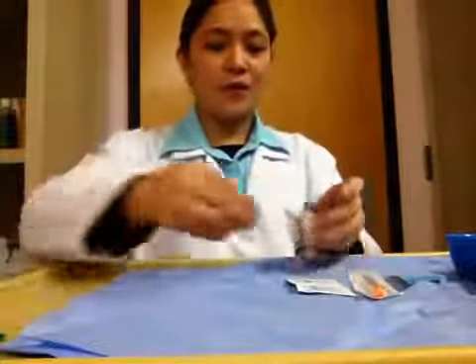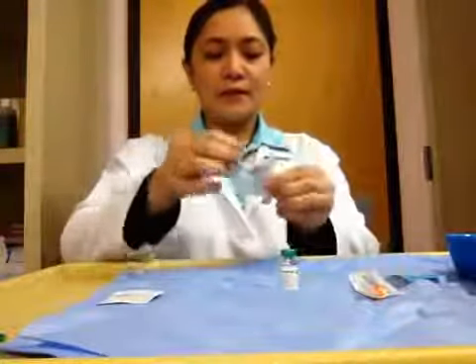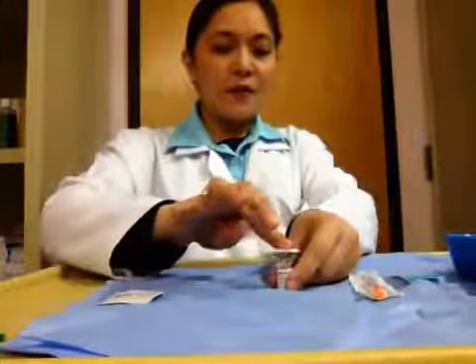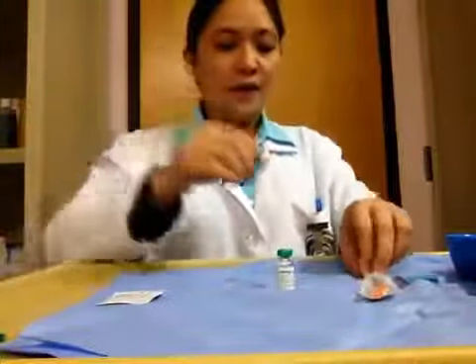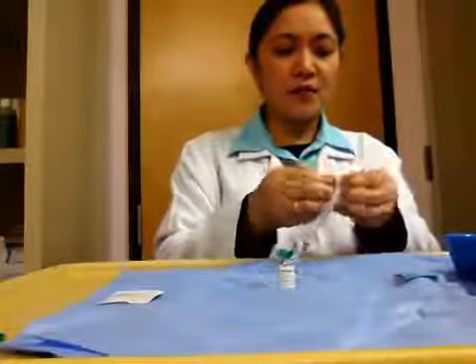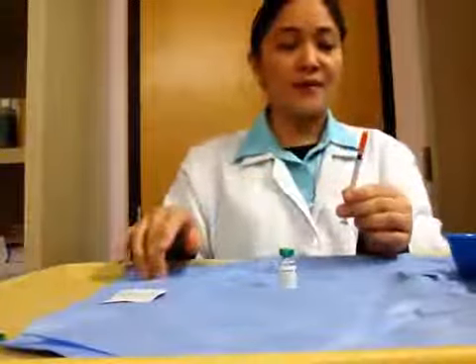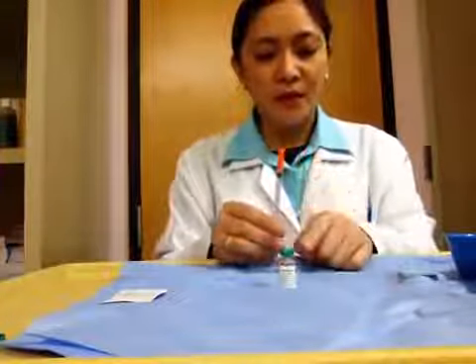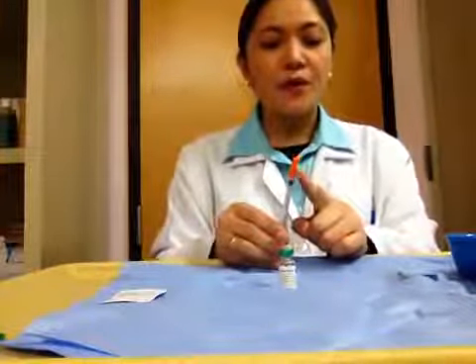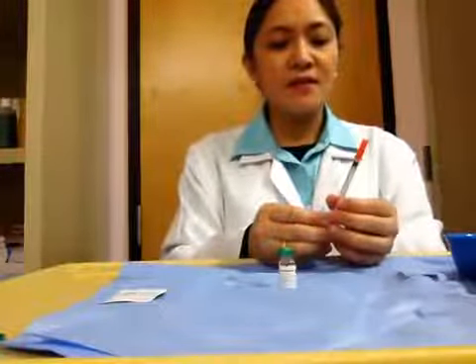So, we have to remove the cover of the vial and then wipe the top of the vial. Open this insulin syringe with the needle attached. This needle cannot be removed and cannot be replaced, so we can use this one as the aspirating needle, and at the same time, we are going to use it as the injecting needle. So, how much is the doctor's order?